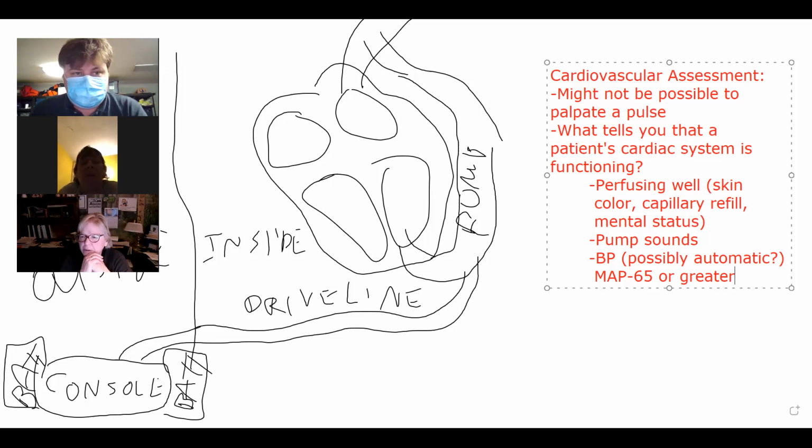Called medical control as well, or? That's right. And when it comes down to things like this, use your resources. Resources are available to you, and medical control might hesitate a little bit, especially in the local hospitals, because emergency medicine physicians are a jack of all trades, master of none type deal. So if you tell them about an LVAD, they might say, LVAD, I don't even know how to spell it. That might be a little bit of a point of contention.